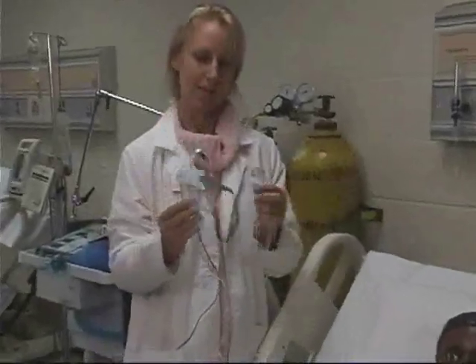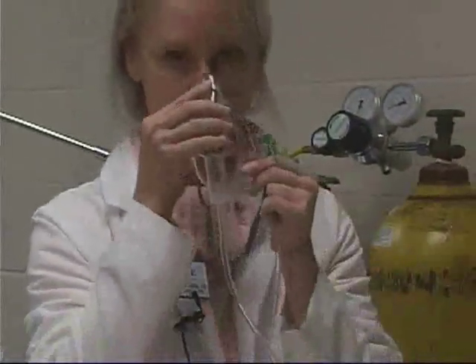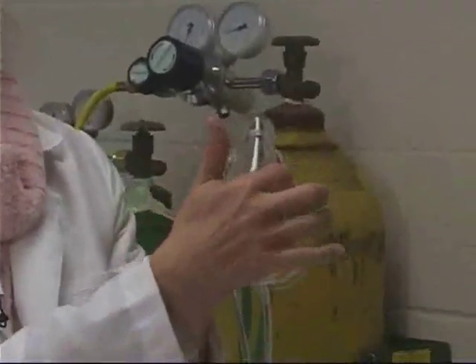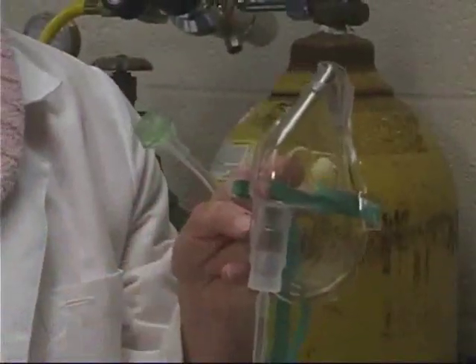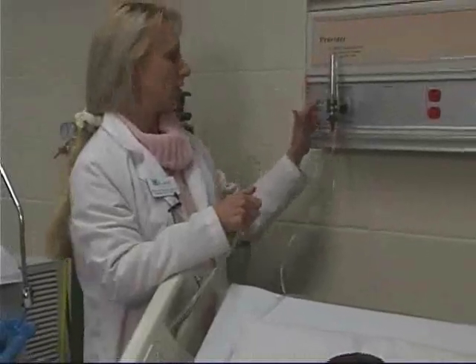Now I'm going to show you a simple face mask. This is a simple face mask — it fits over the patient's nose and mouth. This strap goes around the head. This metal piece goes on the bridge of the nose, and you can tighten this to hold the mask on the patient's face. On the side of this mask are two open holes for air to go out as the patient exhales, and also to help push out air as oxygen flows in. This tubing is similar to the tubing for the nasal cannula and will also get hooked directly to the flow meter.